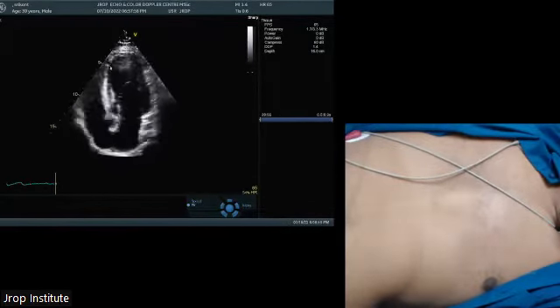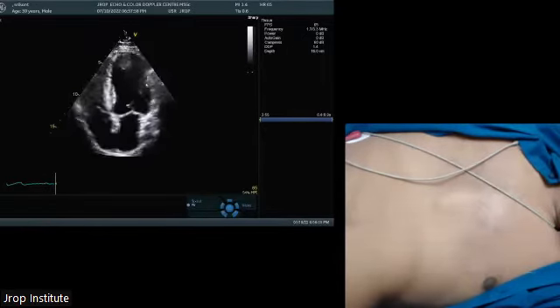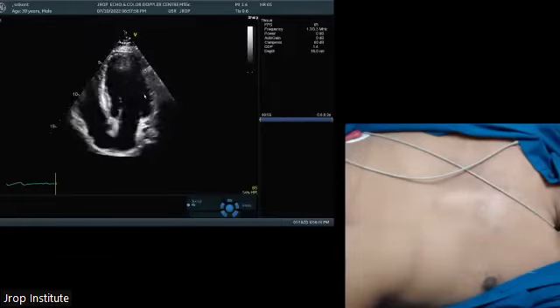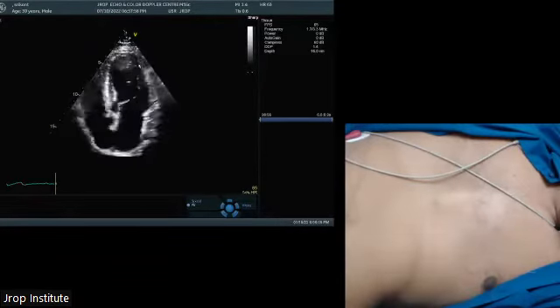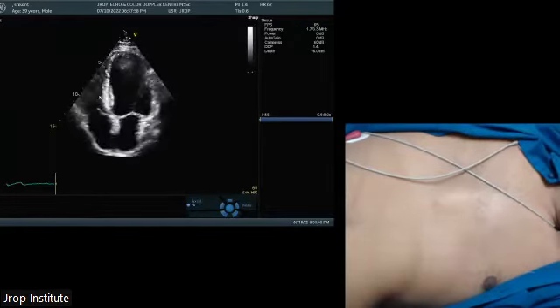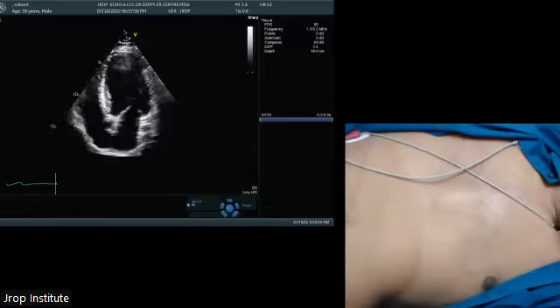Septum is divided into 3 parts based on a middle segment where the papillary muscle is there. So if this is the papillary muscle, this lateral wall is divided. The papillary muscle area is mid lateral. Up towards apex is apical lateral. Towards the base is basal lateral. Same opposite to this is mid septum, apical septum, apical lateral wall.